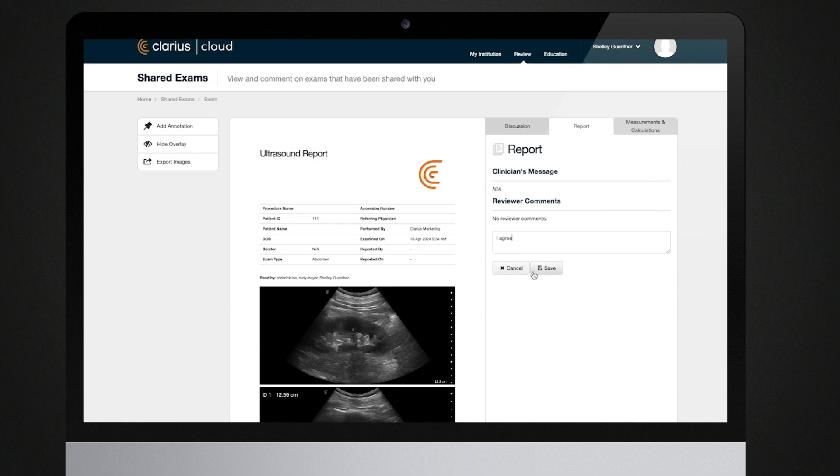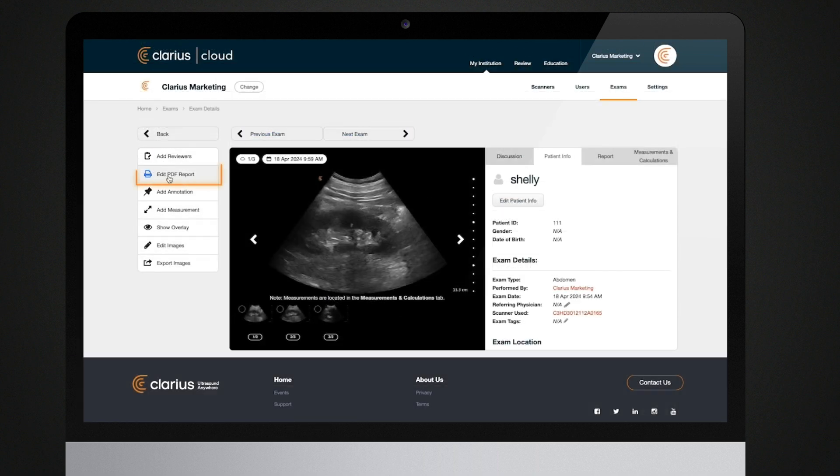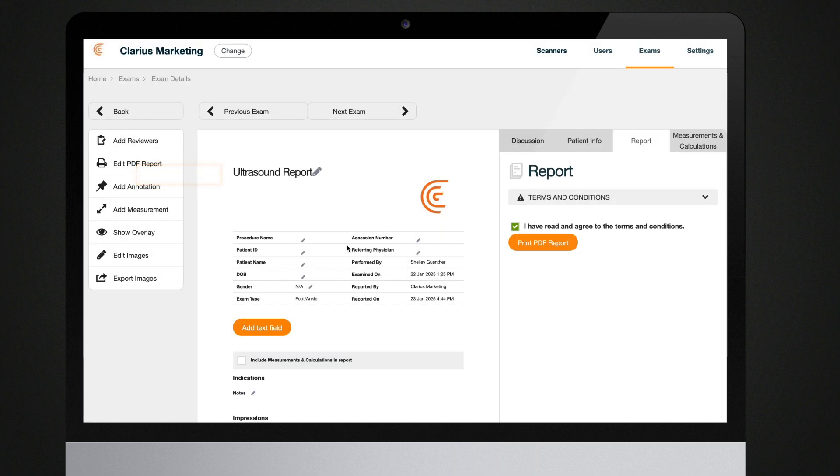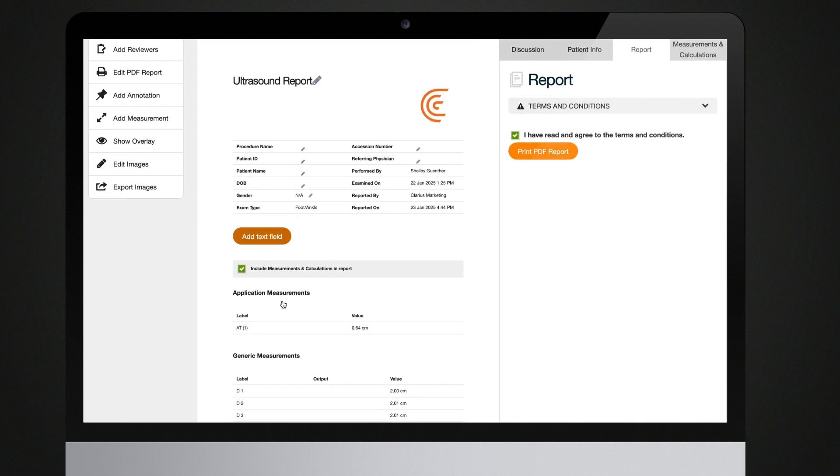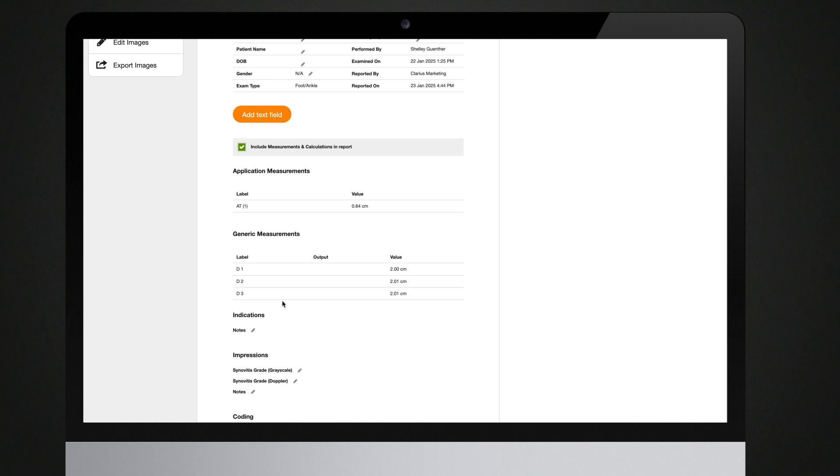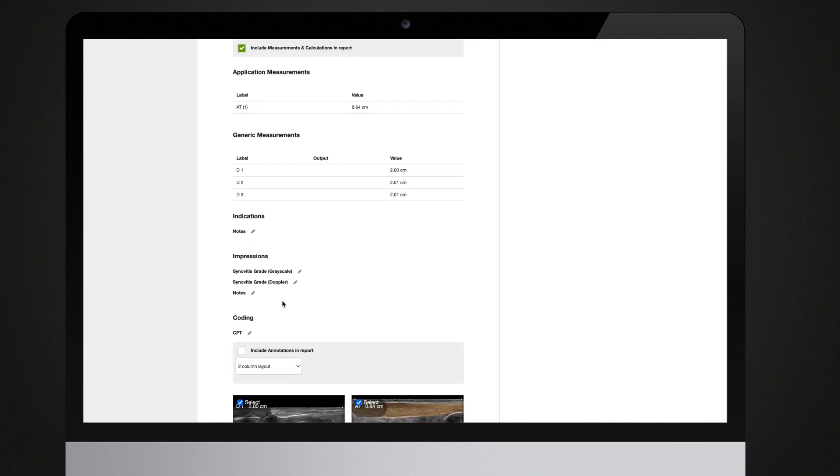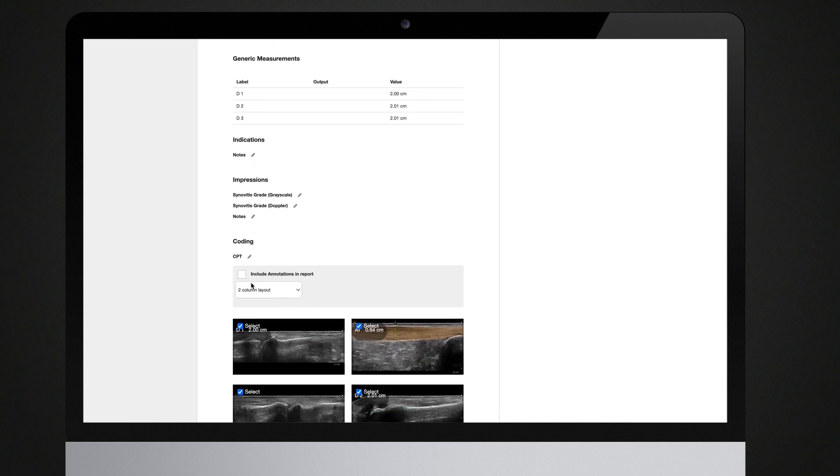Once you're ready to create a PDF report of your exam, click on Print PDF Report. You can choose which reviewer comments to include in the report. You can also choose to include any measurements and calculations or annotations in the report.